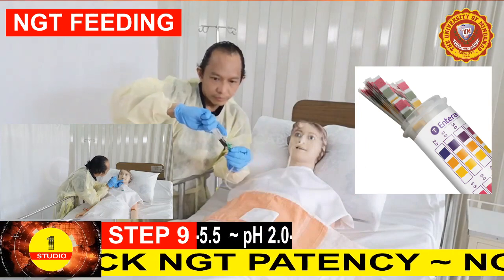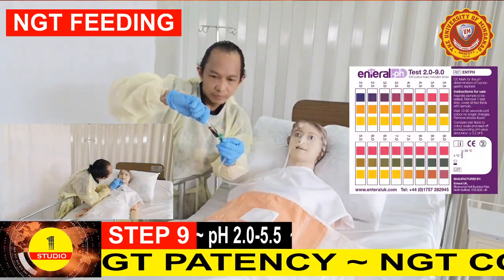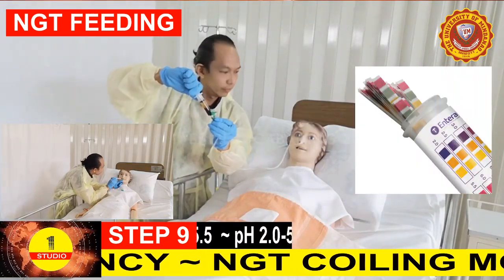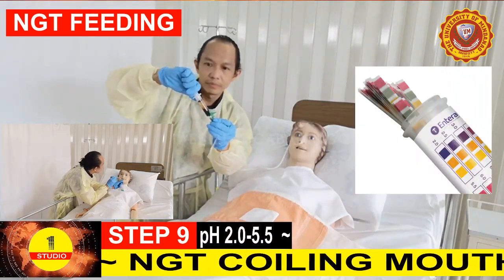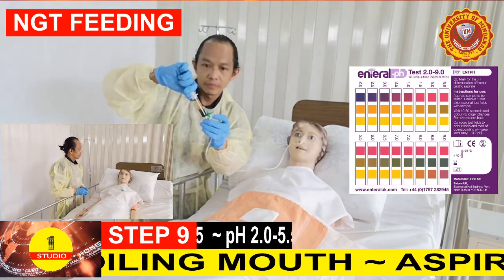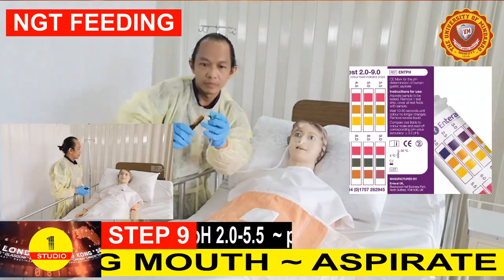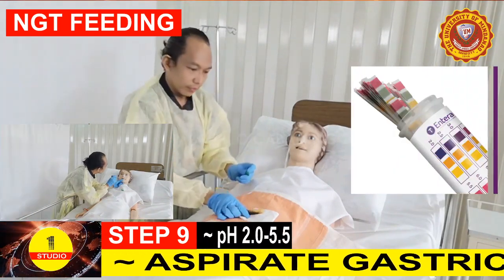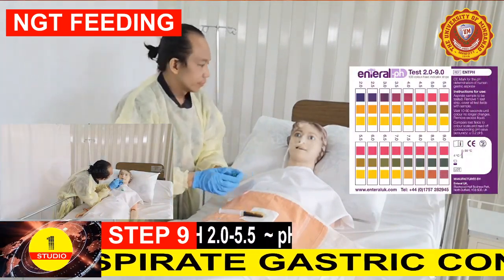Step 9. Check the patency of the nasogastric tube. Aspirate the gastric content, at least 5 to 10 mL, then check gastric pH using an enteral feeding pH testing strip.